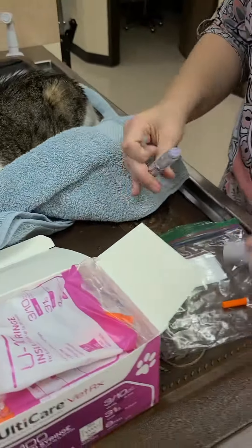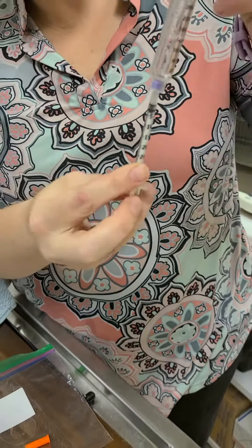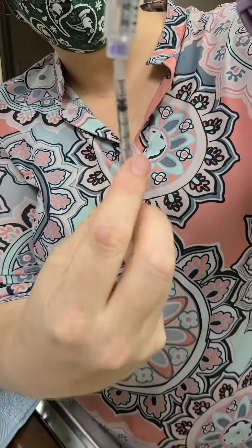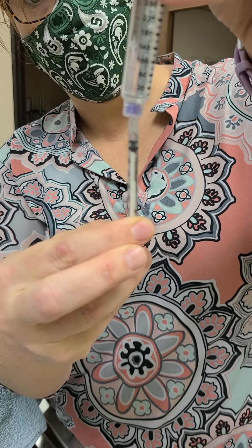Take the cap off and then puncture it like that. What I usually do is draw up a good amount so you can see it, and then push it backwards — five, four, three, two.